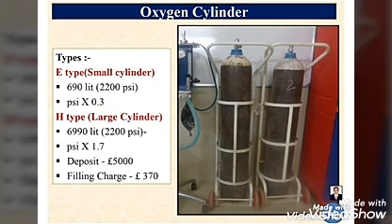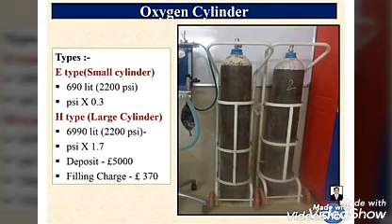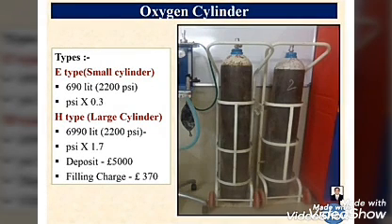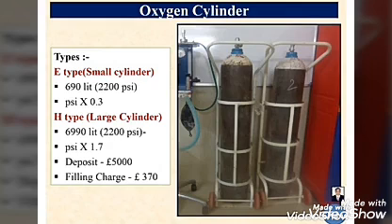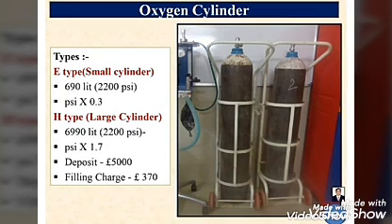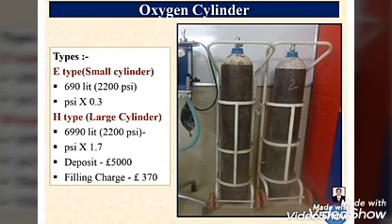So for those who are interested in purchasing, it's available on a deposit basis. Generally the deposit is 5,000 and the refilling charge is 370 rupees for the large cylinder in Gujarat state. I am mentioning these refilling charges for Gujarat state. I don't know what the charges are outside Gujarat.